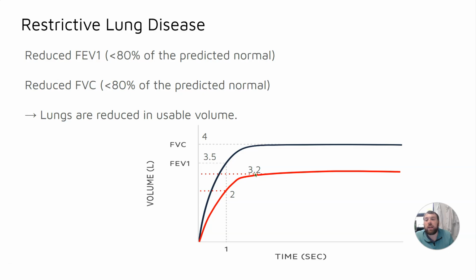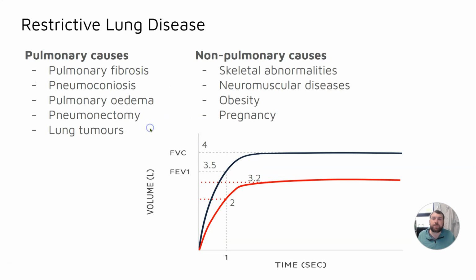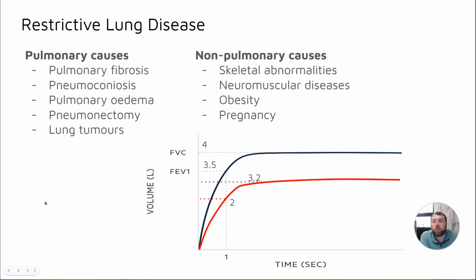So this would indicate that the lungs are reduced in the usable volume and they're not getting as much air into them as they need. You can see some common causes for this, whether it's pulmonary conditions causing this, like pulmonary fibrosis or pulmonary edema.